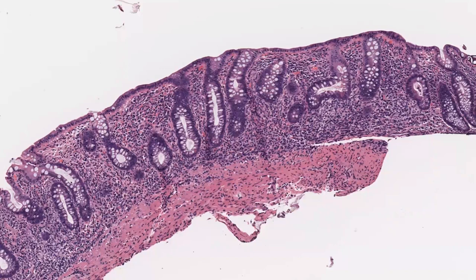So the thing is, what we are able to see here, okay, we can see these elements of inflammation, and we can see that there is a crypt architectural distortion, but then what? That's the problem. Okay, and basal plasmacytosis, I agree with you, there is a basal plasmacytosis, but then what? Okay, then what are you going to call this? Are you going to call it inflammatory bowel disease? Or are you going to just say this is an inflammation, chronic inflammation? Or what are you, okay, you will assess the activity, all right, and then what, right?